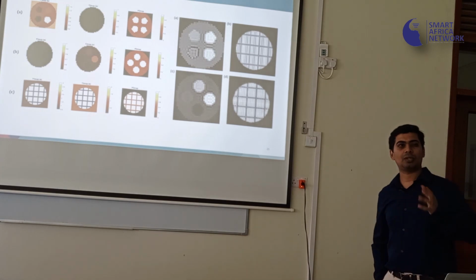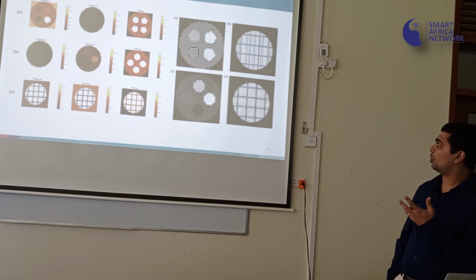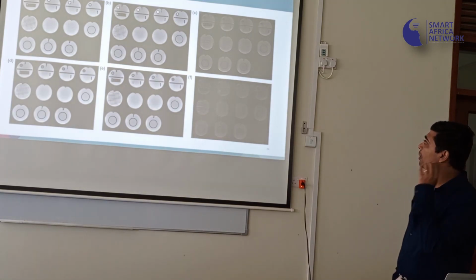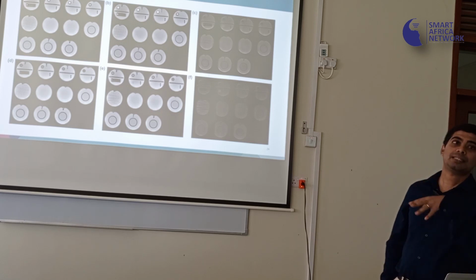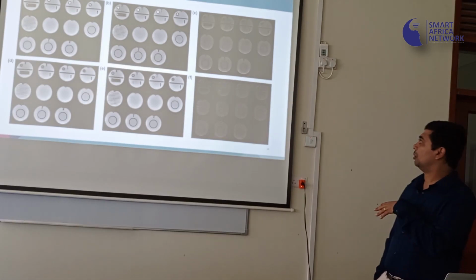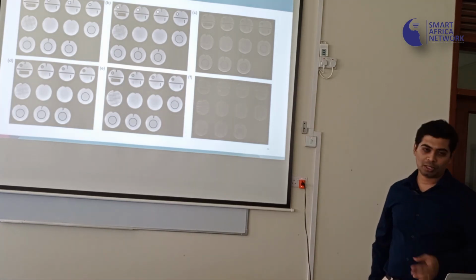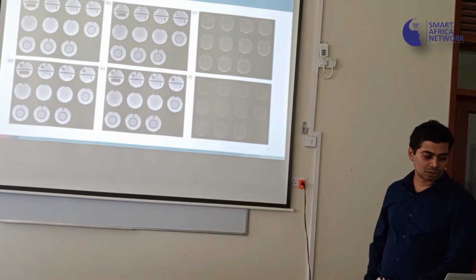So this is what you did on the computer. We were able to simulate it, and then show this is the kind of images that you're going to get. So here's the comparison. A is using our tool. B is what Siemens actually produces from their own scanner. And the last column is the difference between the two. So you can note, using these open source programming tools, you're getting pretty close to the vendor image quality.